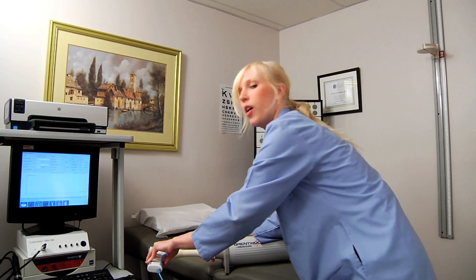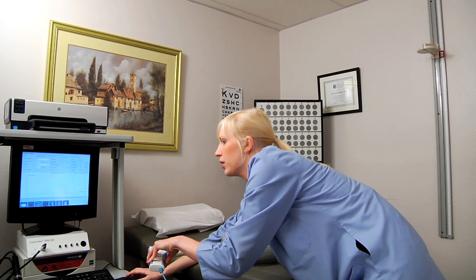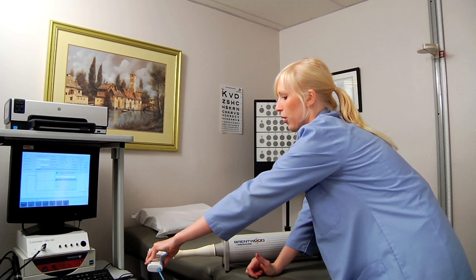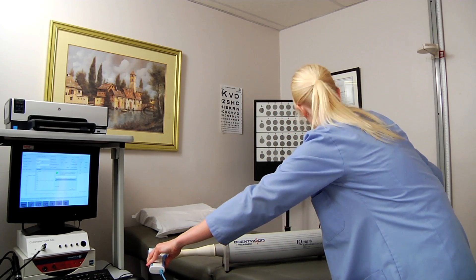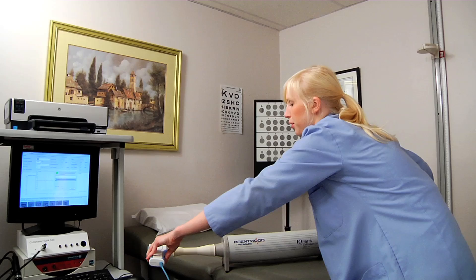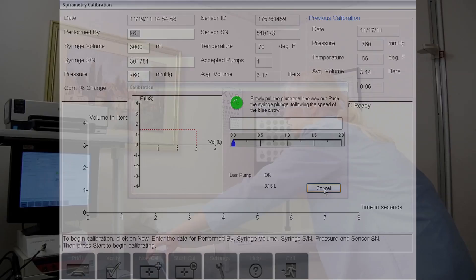Once you're ready, this is going to involve a little bit of hand-eye coordination. Go over to the computer, hit New Calibration, and then hit Start Calibration. Hold the mouthpiece with the syringe, put your hand on the black syringe, and push. You're going to be the green indicator and follow the speed of the blue arrow. You're going to do it three or four times, following the speed.